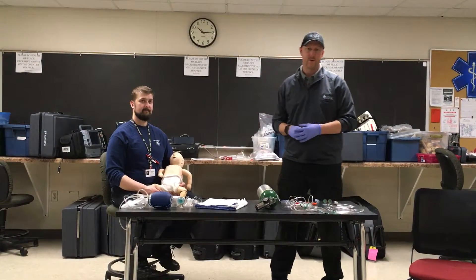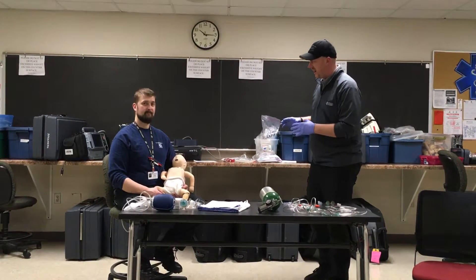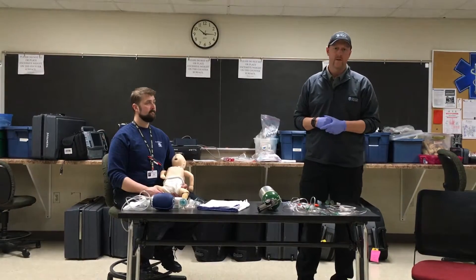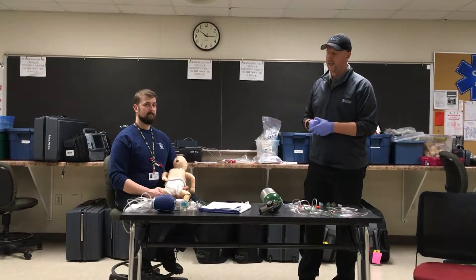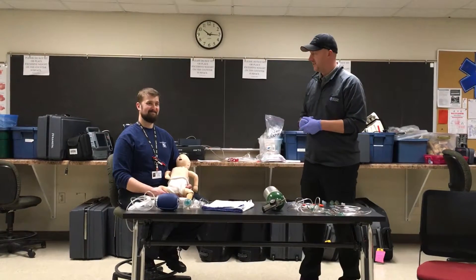We're going to demonstrate the Pediatric Respiratory Compromise Station for the National Registry Advanced Psychomotor Exam. We have our dispatch — we're basically going to be dispatched for a one-year-old pediatric patient having respiratory distress. Greg's going to play the part of the father taking care of his child.